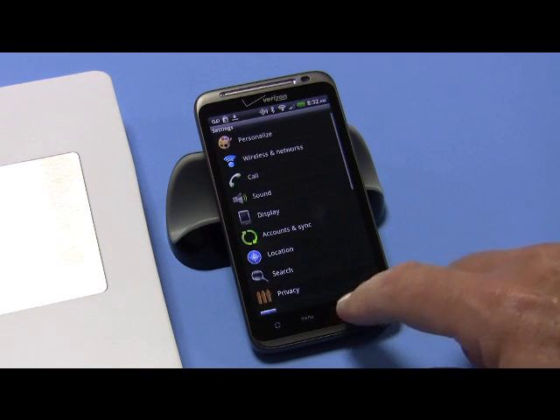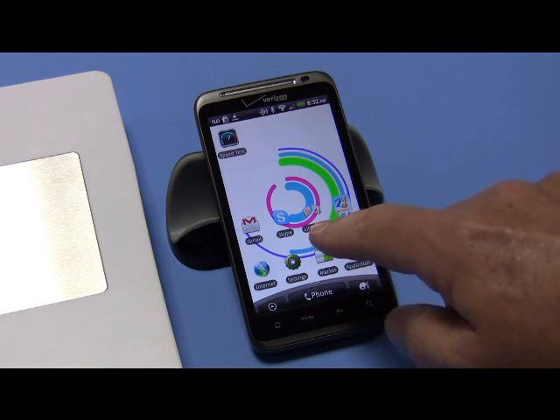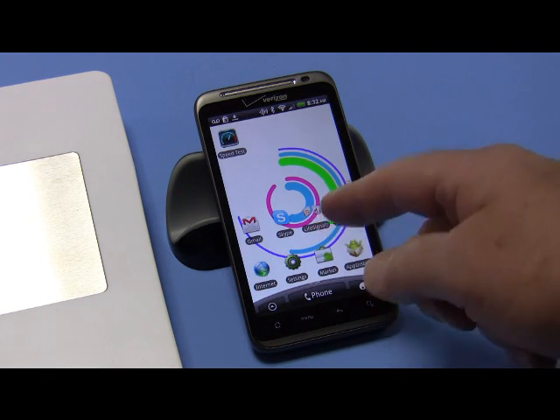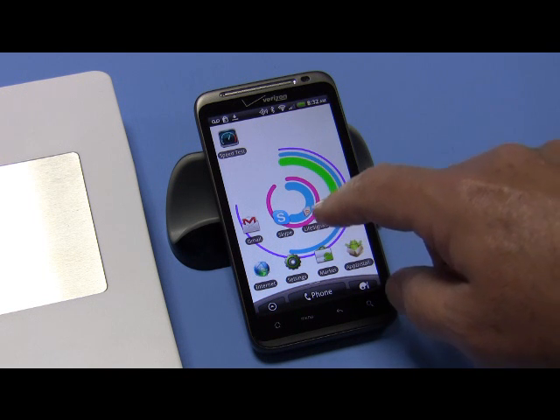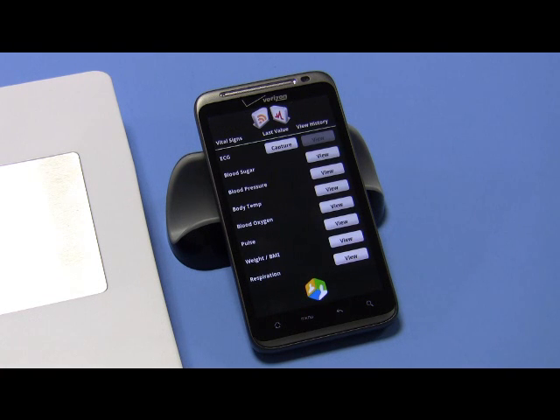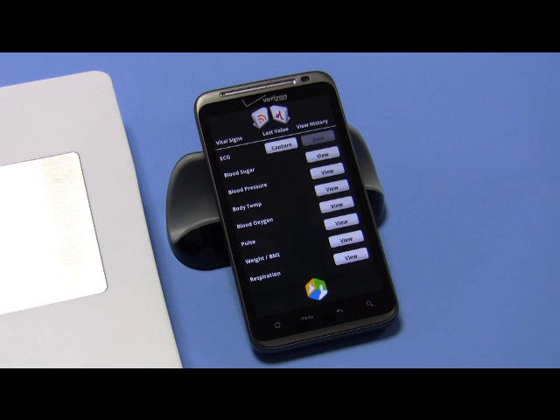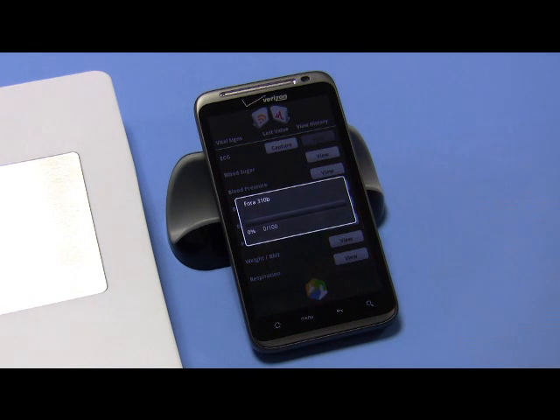Then hit the back arrow key and go all the way back to the main screen. In your case it'll be the Net Intake application — I have the Life Signals application on here, but hit your Net Intake application and go to your measurement screen. There it is — it's communicating, already connected to weight scale.